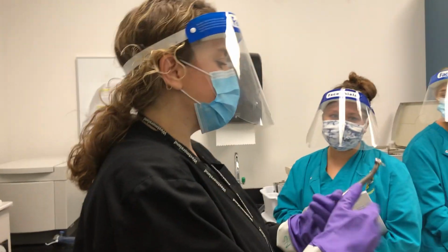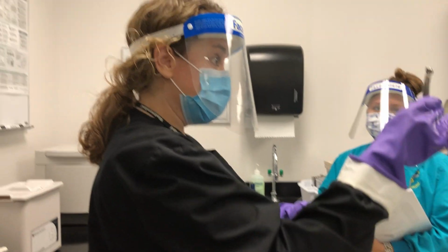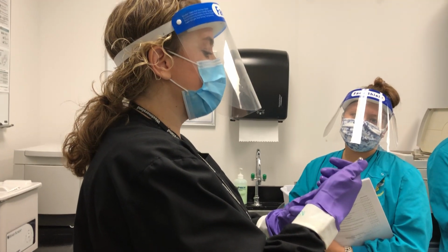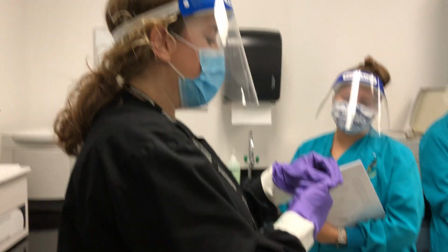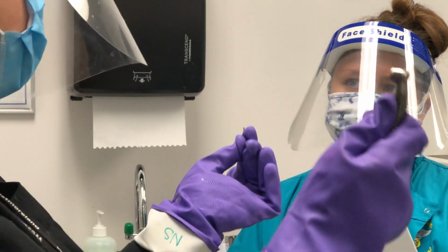Okay. So that's going to be another part of your next process. This is a friction grip because it's a high speed, okay? So all we're going to have to do, it's a push button. You're going to push on the back and you're going to grab onto the burr. As you push, you're going to pull straight out, okay? And then you can do the same thing in reverse.